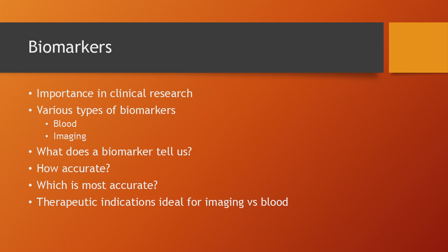And we also know how to apply algorithms that try to minimize the variability between the different methodologies that we can use. So that means that we have to work in consensus. For example, to apply always the same image filters or to apply always the same movement correction algorithms, and try to give importance to these algorithms and try to achieve a consensus in all of them, and also in the algorithms that we calculate.